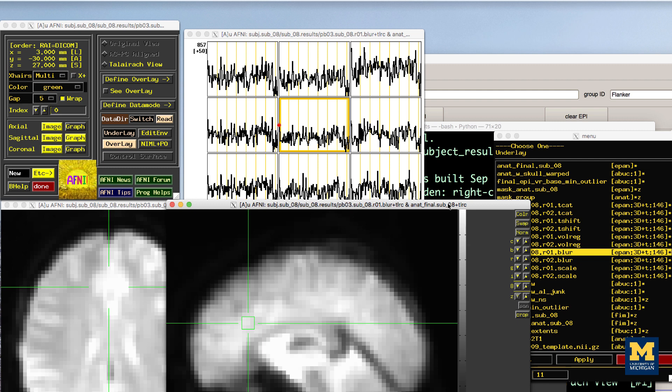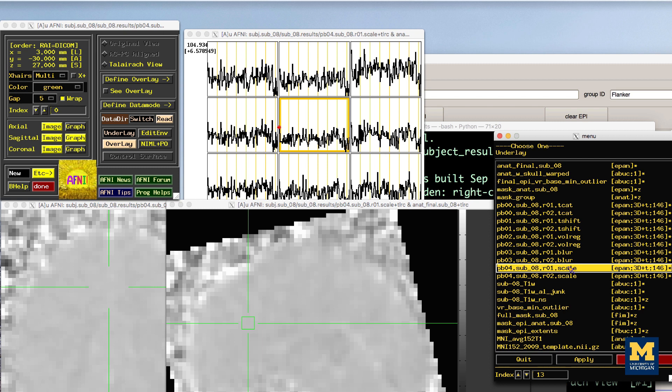The last preprocessing step generates scaled images in which each voxel has a mean signal intensity of 100. This allows us to specify any changes relative to the mean as percent signal change. In other words, a value of 101 could be interpreted as a signal change of 1%.